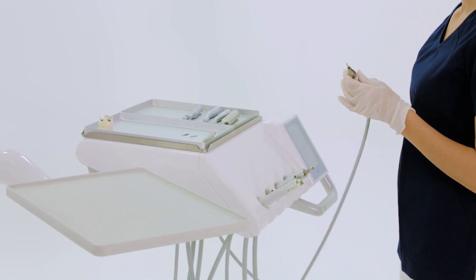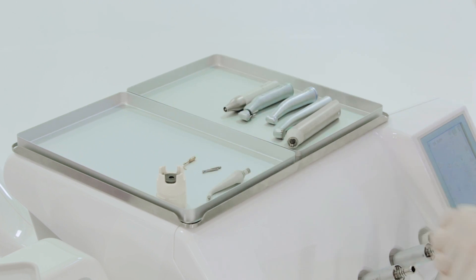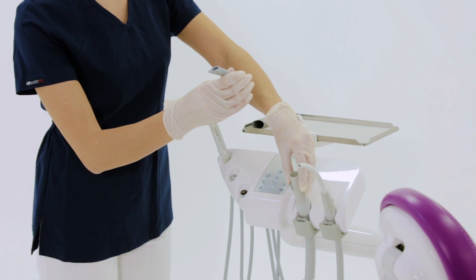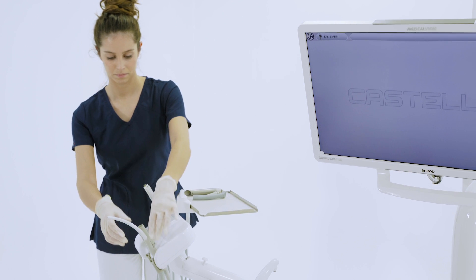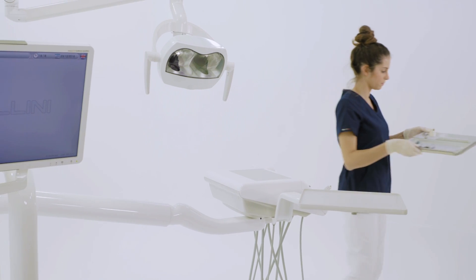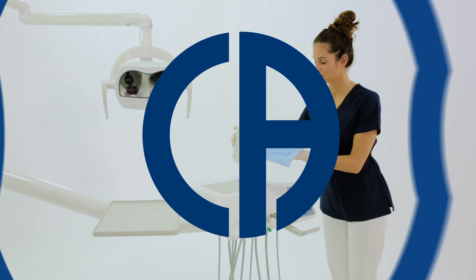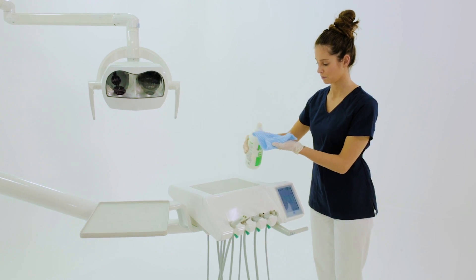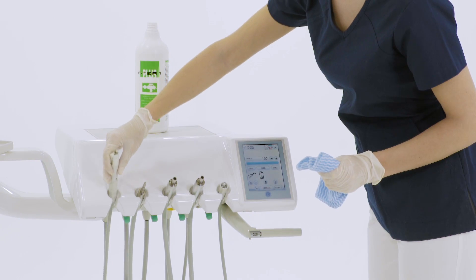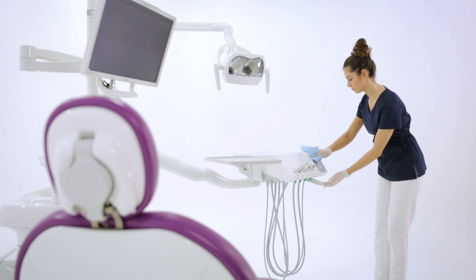The assistant removes the dynamic instruments without their tips and burrs, and the cannula ends, and takes them to the sterilization area. The assistant then cleans and disinfects the dental unit surfaces.